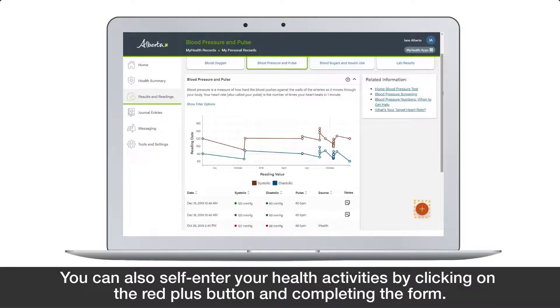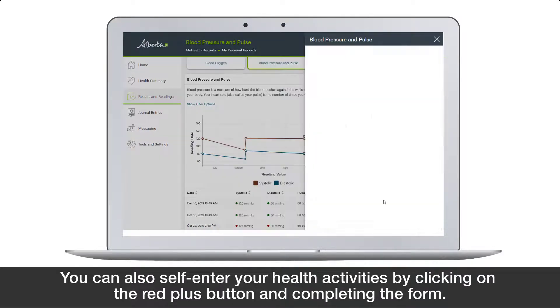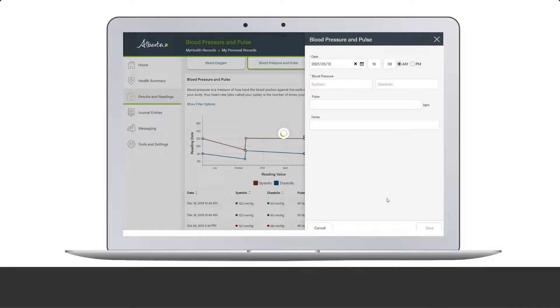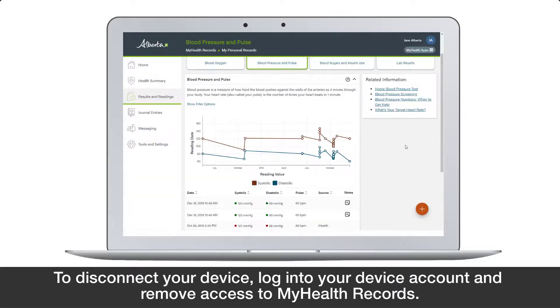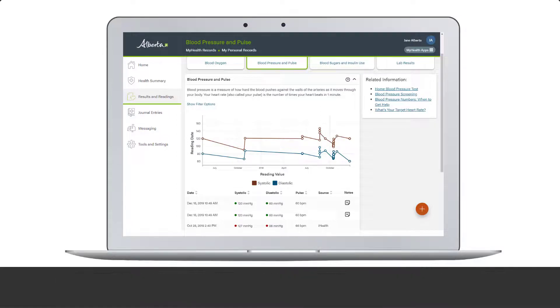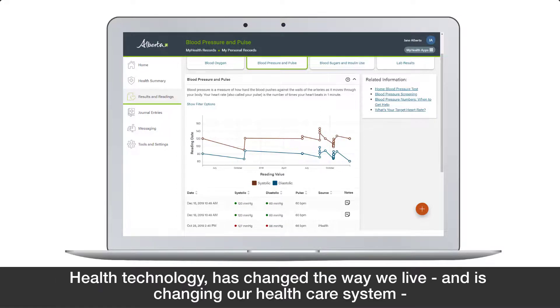You can also self-enter your health activities by clicking on the red plus button and completing the form. To disconnect your device, log into your device account and remove access to My Health Records.